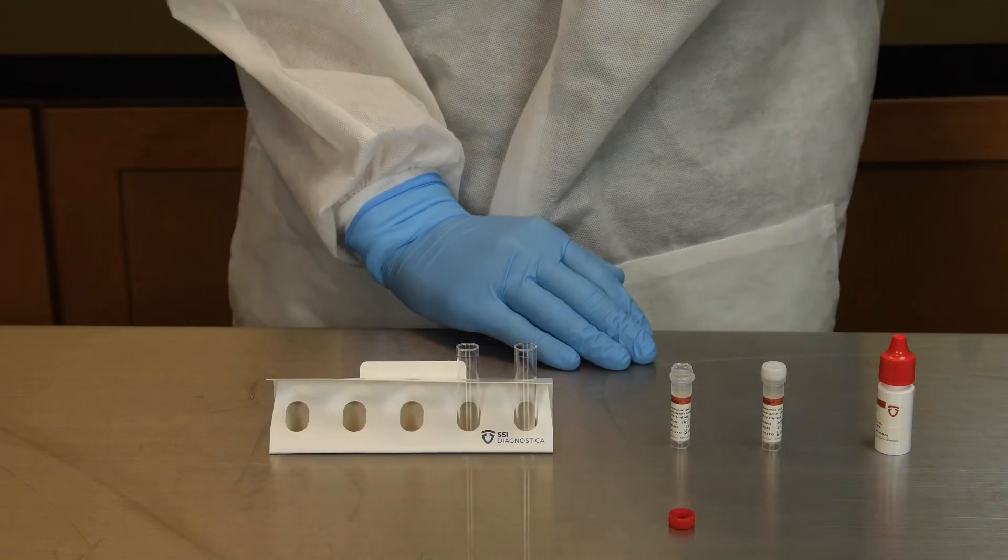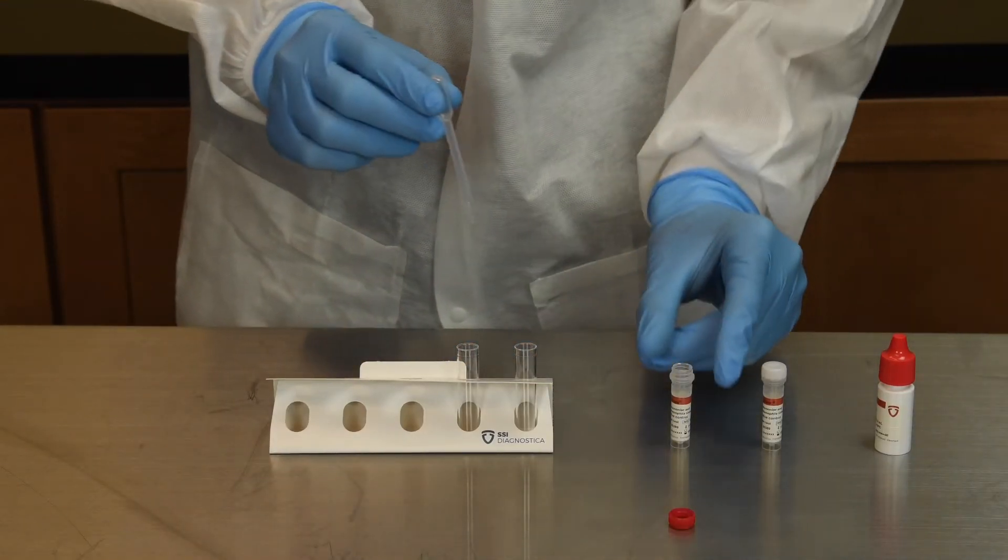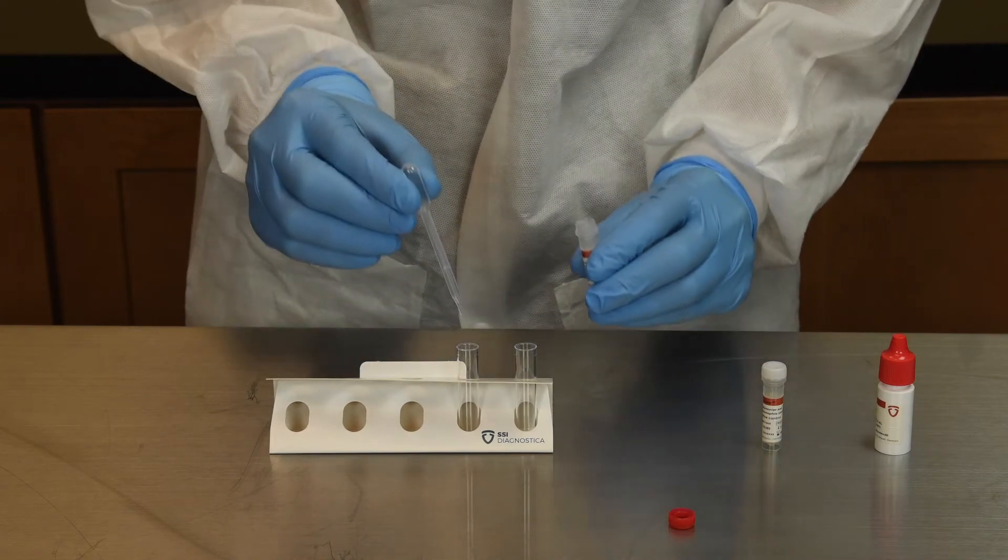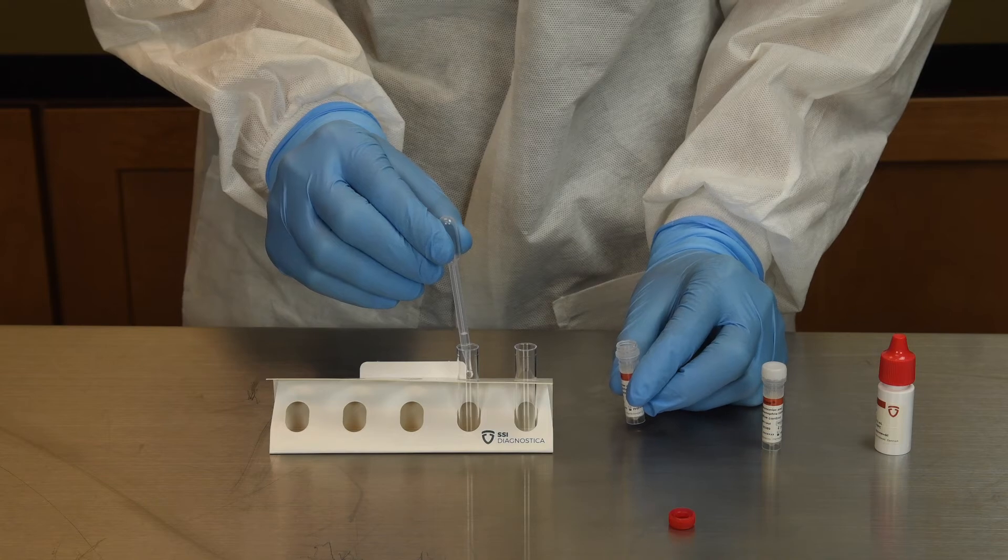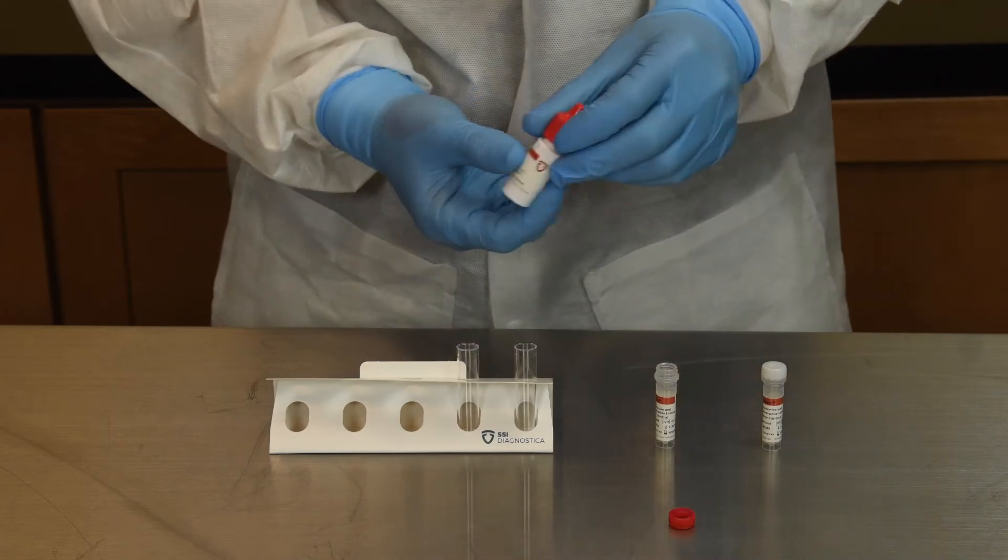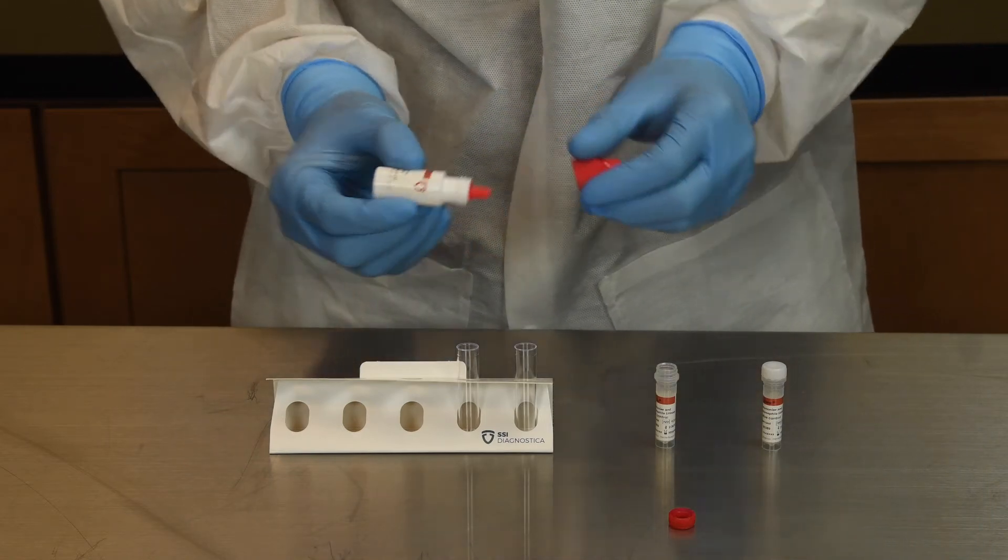Before starting a new kit, please perform a positive and negative control. This is to ensure the ImmuView test works as intended. You will need two ImmuView test strips to perform the controls. This is why there are 22 tests in each kit.